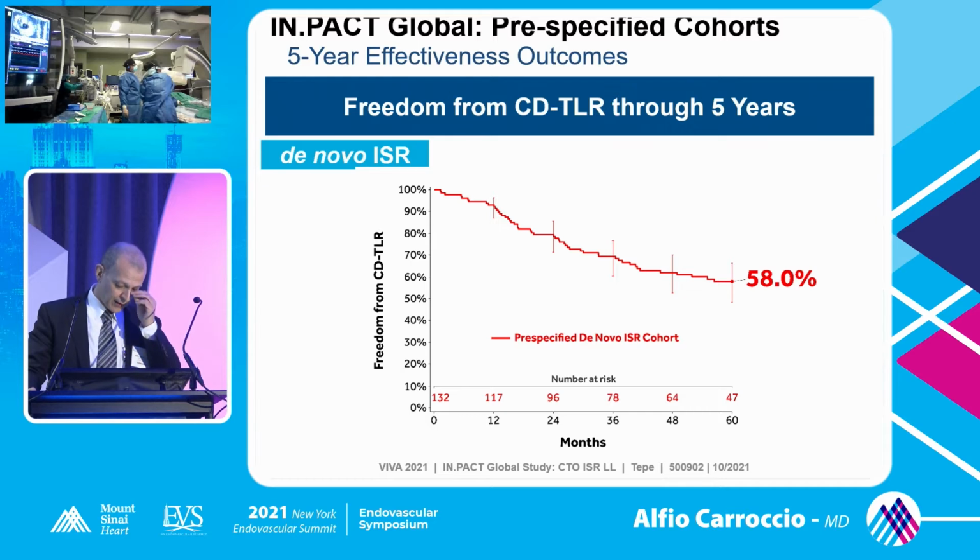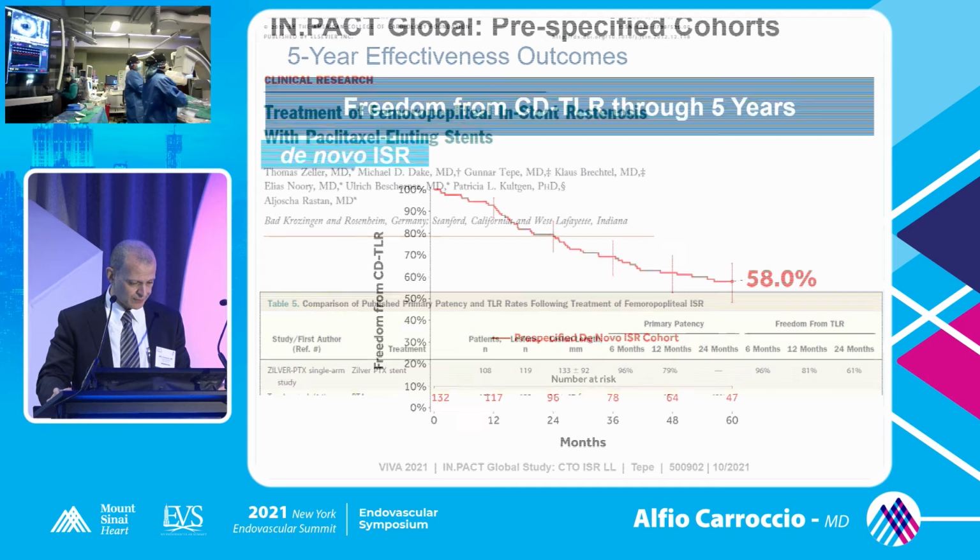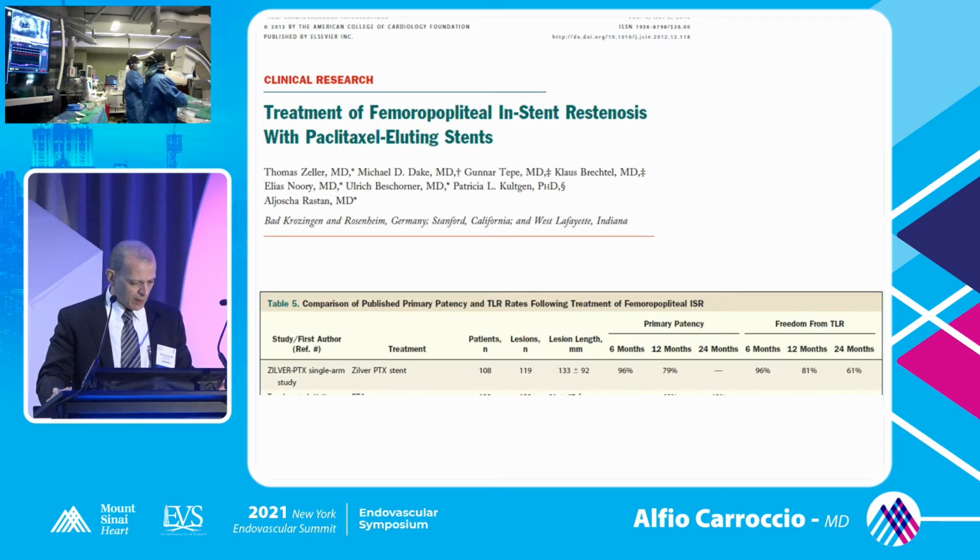Significant number of them were calcified, and the overall stenosis for the non-occluded in particular was high grade. So what do we find at 5 years? Freedom from TLR, 58%, which to me I think is actually pretty promising results, given that historically the benefits of any of this have not been great. If you can promise a 50% patency rate, it's information you want in the back of your mind as you come up with an algorithm, because it really comes into play in what you are doing this for and so forth. Well, how about the drug-coated stents?